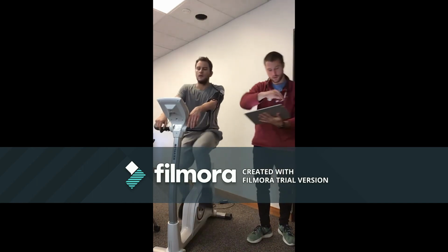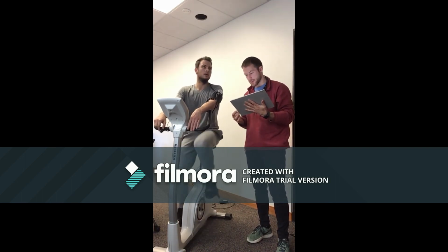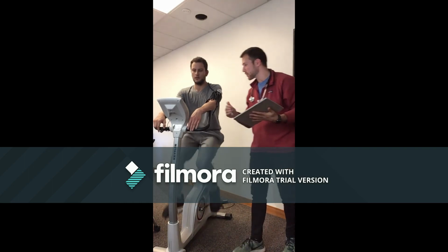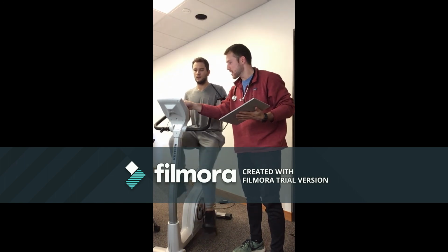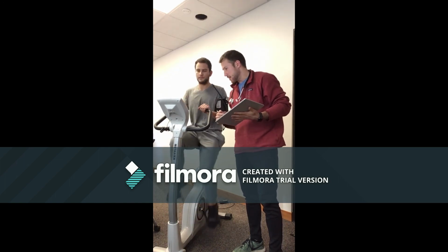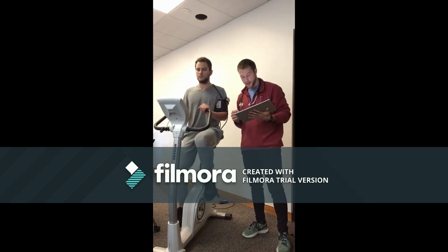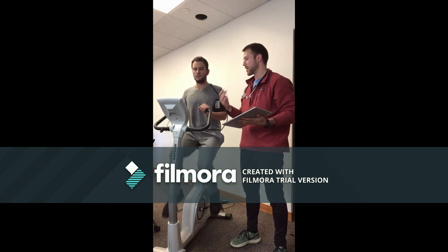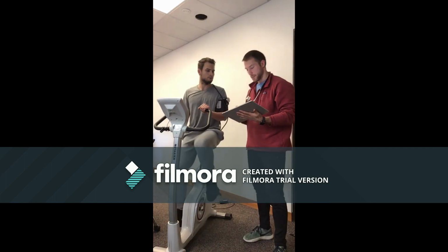Okay, awesome. So your blood pressure that time was 140 over 78, so nice and consistent there. We didn't see any drastic fluctuation that would be contraindicated to immediately stop the test, so why don't we do our cool down. I'm gonna bring you back to that range that we were in for our warm up. You're gonna be at 75 watts here. Again, keeping it at that 50 RPM, so slow it down just a tiny bit. Looks pretty good. And we're gonna do this for also about 3 minutes, just trying to get that heart rate back down, get you back into that baseline where we were for that original warm up, help prevent some of that blood pooling.